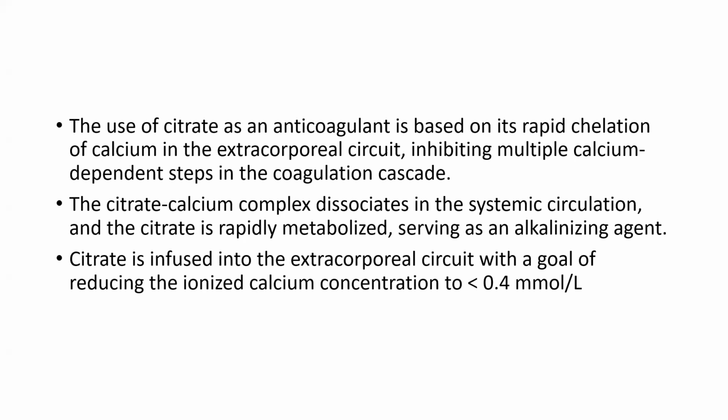The use of citrate as an anticoagulant is based on its rapid chelation of calcium in the extracorporeal circuit, inhibiting multiple calcium-dependent steps in the coagulation cascade. The citrate-calcium complex dissociates in systemic circulation, and the citrate is rapidly metabolized, serving as an alkalizing agent.